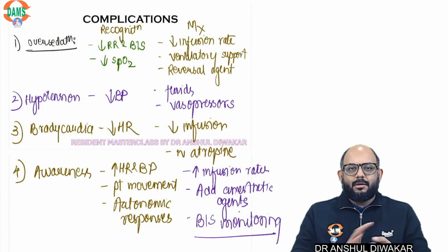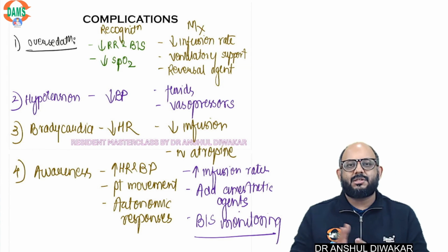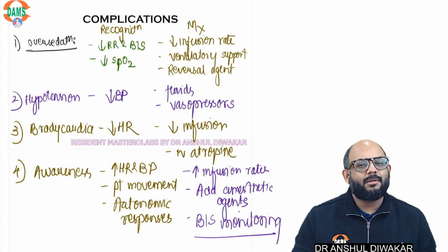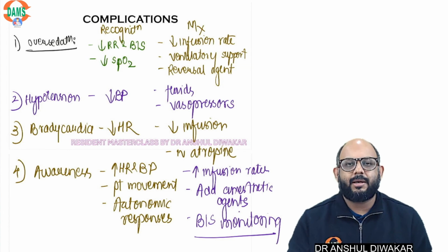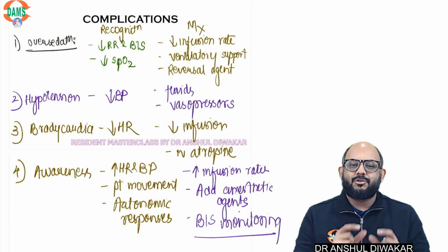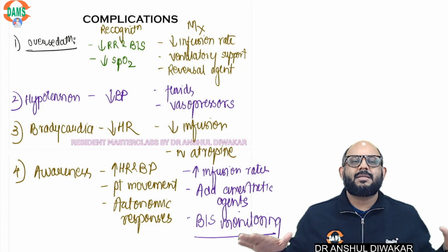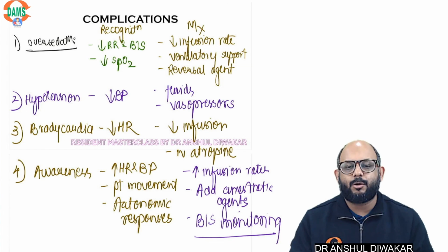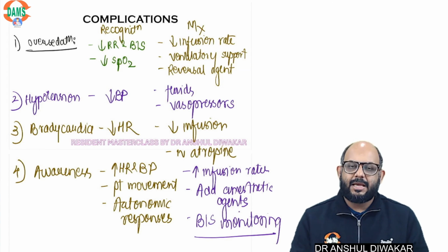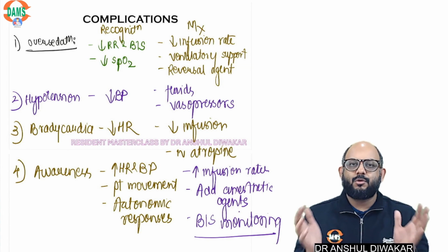So remember that there is always going to be a difference between the target concentration and the actual achieved concentration, and you cannot always measure the actual achieved concentration. You can do a lot of pharmacokinetic modeling and decide that at this infusion rate this will happen, but you can never be guaranteed. So there is always an element of error, which is the mean error, and you can never get a system with 0% error. There is usually a 20 to 30% error when we are using these TCI pharmacokinetic models.